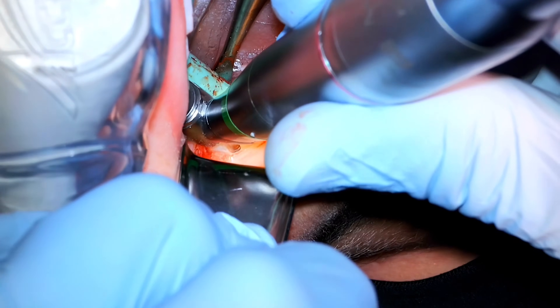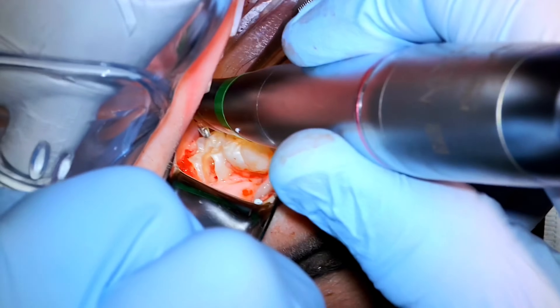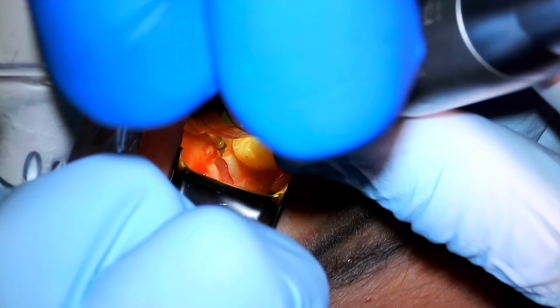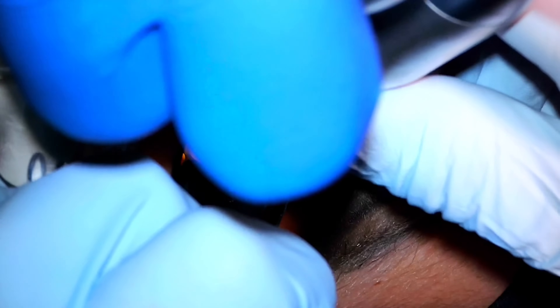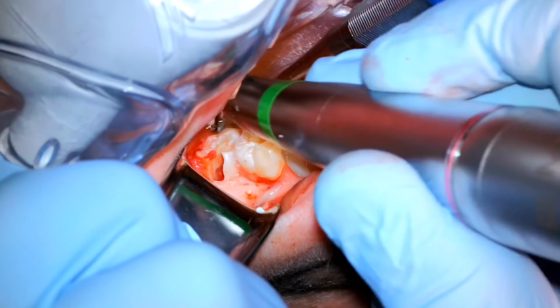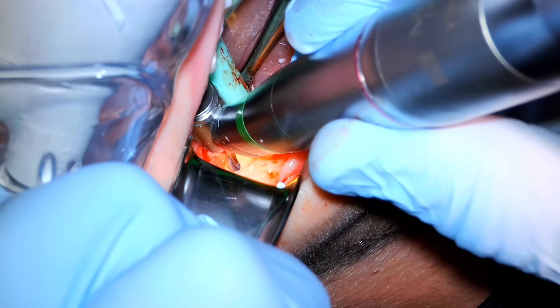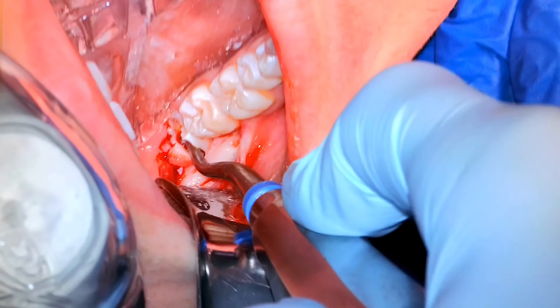Again it's a 45-degree handpiece with a 703 bur, and we're cutting through there. You can see the pulp chamber right there, peeking out — that's what we're looking for. Identifying the pulp chamber gives us some clues about our depth relative to the flutes on the bur. It gets a little trickier when your assistant gets their hand right in your face — that happens sometimes. Not to worry — I could see just fine; the camera was obscured. Never cut blindly — always make sure you can see what you're doing.